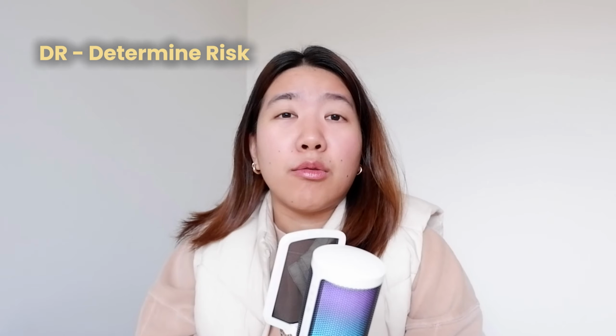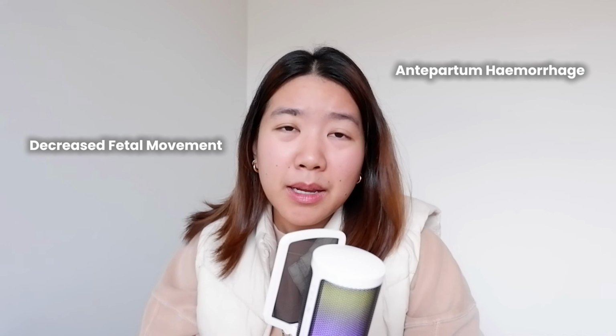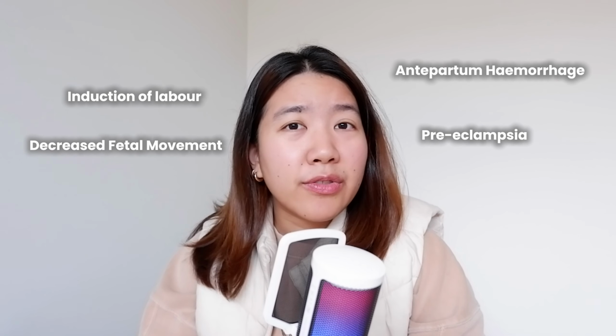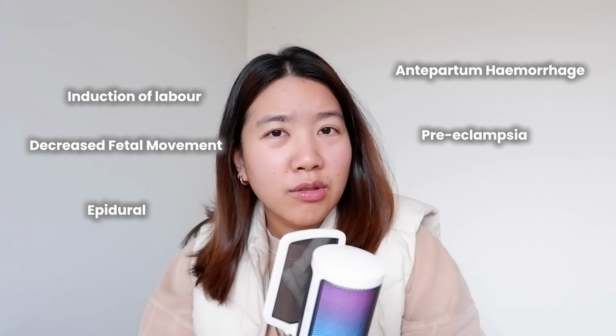Let me walk you through each one, and I will show a CTG strip as well so we can see the same picture. Determine risk. The very first thing you do, before you even look at the CTG, is ask this question: why is this woman on CTG in the first place? What is the clinical reason? Common reasons can be decreased fetal movement, antepartum hemorrhage, preeclampsia, she might be having induction of labor, she might have an epidural, or she's on an oxytocin infusion, or many other reasons. The reason really matters because it will tell you what you are watching for and how concerned to be about what you see.